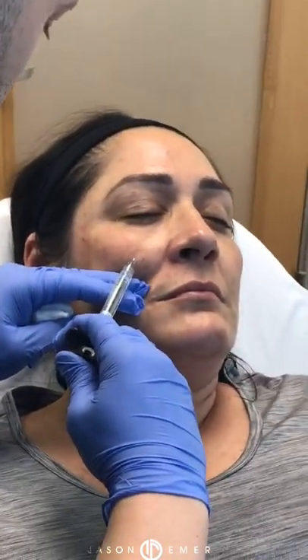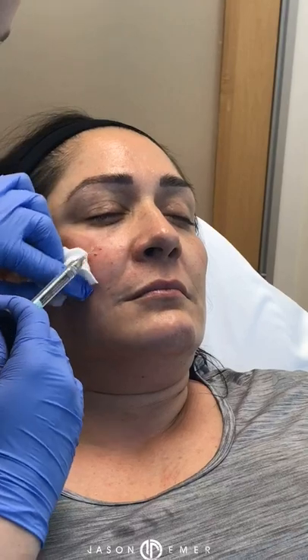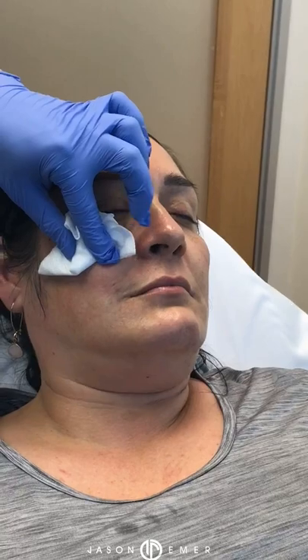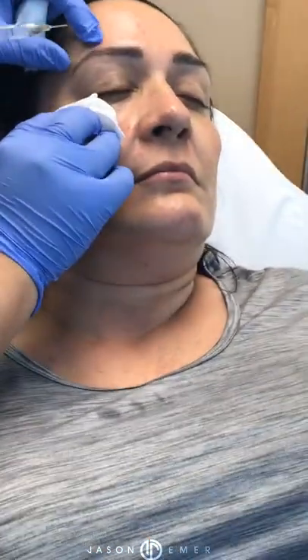Sorry. Deep breaths. One more deep breath. Okay, hold right there. Perfect. Now I'm going to let that sit a second. I'm going to do now a little to her eyebrow because I like to get a little bit of lifting, and then I'm going to finish up the mid-face. So we're going to come up to the brow. We did the deep brow.